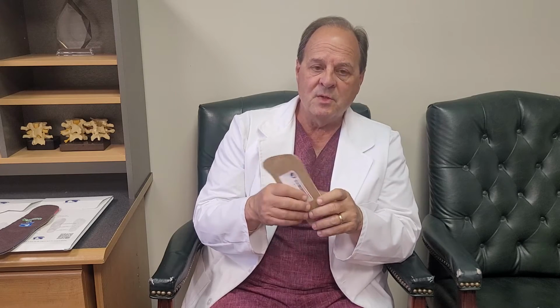If there's any sort of support in the shoe, you want to take that out. If it's just a flat pad, that's fine, but if it's got any humps in it, like what they call a pseudo arch, then you have to remove that. And if it's not removable, then you can't use the orthotic in that shoe. Most of them you can pull out though.